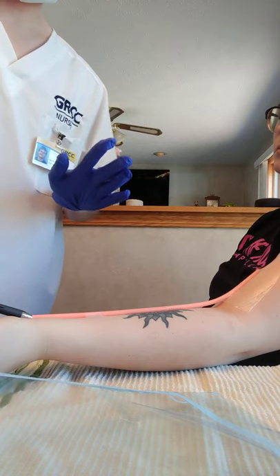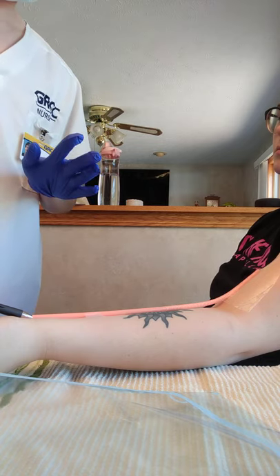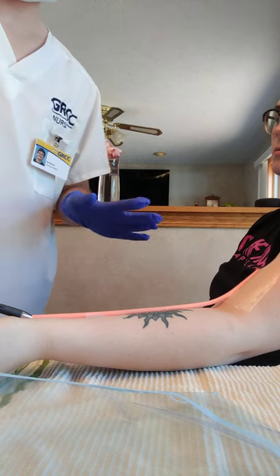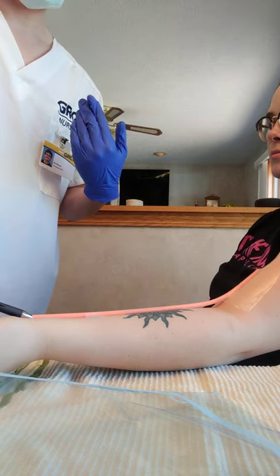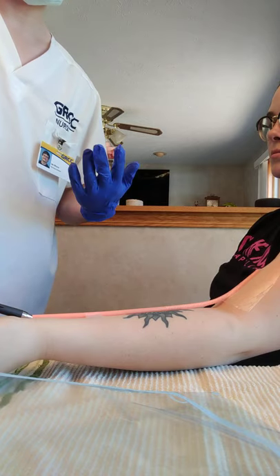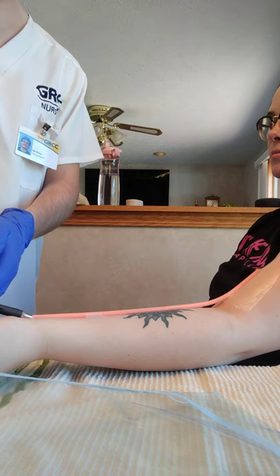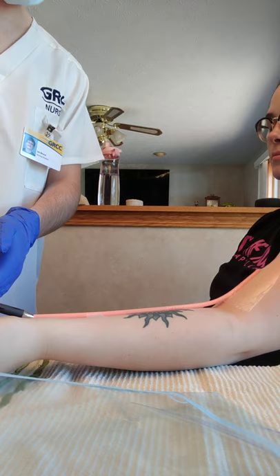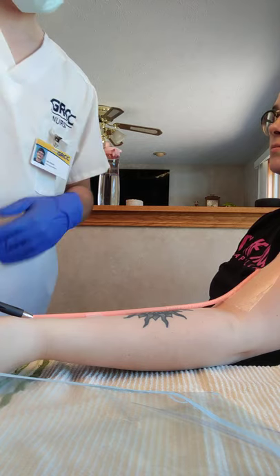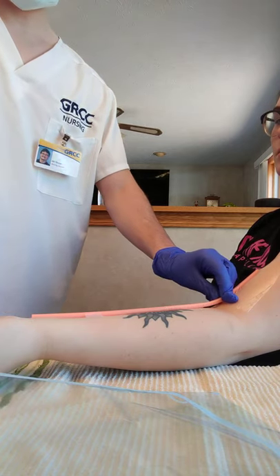And next, I'm going to inject 10 milliliters of the normal saline solution while checking for patency and noting any resistance in case there's blockage. If there was blockage, then we might have to notify the provider in case there's a blood clot or something else. So now I'm going to slowly inject the solution. So far, no resistance. It's looking good. All right, now that I finish injecting solution, I'm going to clamp the port again and remove the syringe.